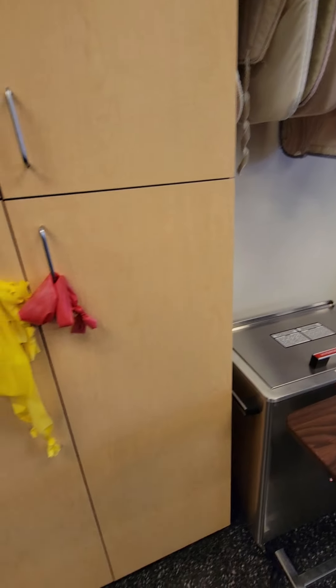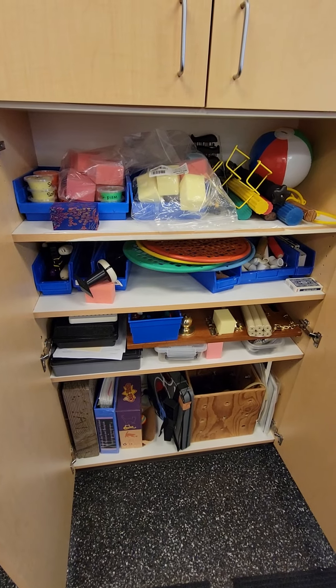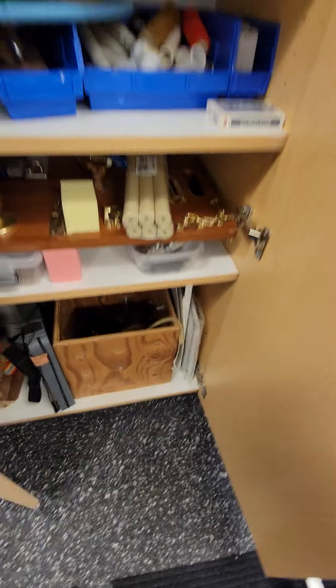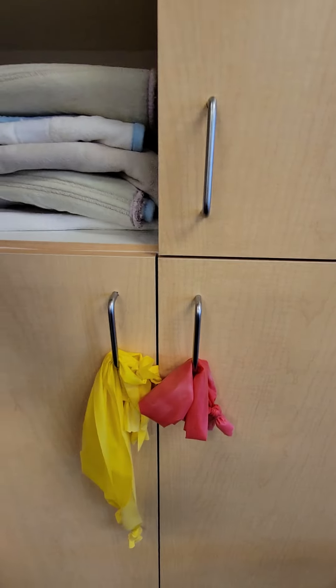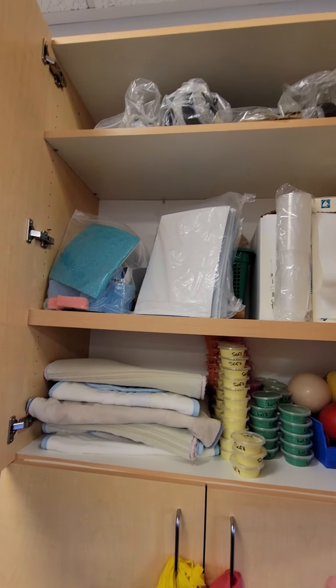Of course the hydroculator packs, and this cupboard is probably the same as when you were here last. Most of your exercise equipment, mirror therapy, cat toys — is in this lower cupboard, with some TheraBand and some extra hot pack covers and putty up here.